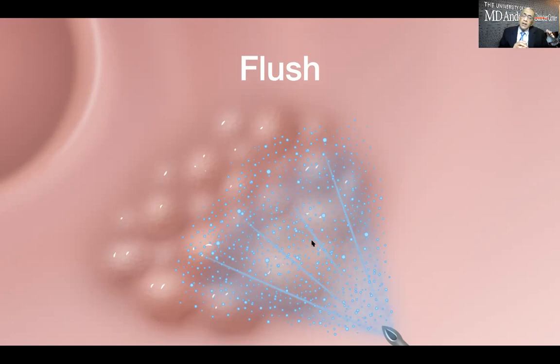If the lesion is non-dependent and you cut, and if there's bleeding, you can find that bleeding spot very easily. If the lesion is dependent, that means the fluid is sitting there and you cut the lesion and it bleeds, you can't find that bleeding spot because the blood pools there and you will have a hard time finding the bleeding spot. So when you're doing a resection, try to keep your lesion in a non-dependent position so that if in case there's bleeding, you can control the bleeding easily.